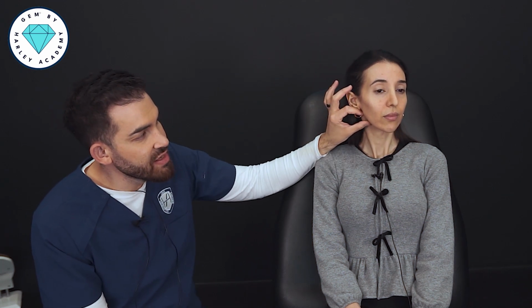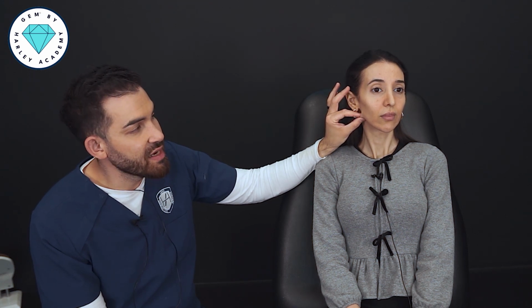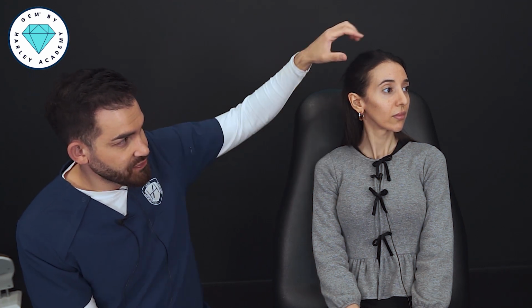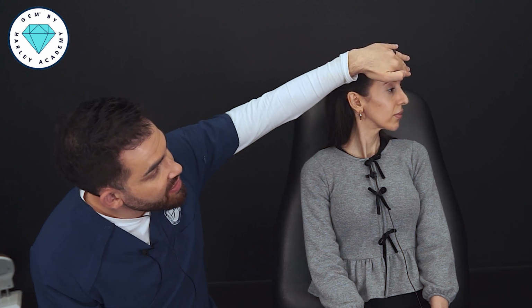Moving into the lower face, I think this is really where we see a real opportunity. I think that the bizygomatic distance is very wide. The bigonial distance is relatively narrow. And in this case, we can afford to really create some structure here in the lower face. I want to widen this here because I think it will balance the face. And then in addition to that, I'm going to try and continue the jawline all the way through to the chin. On profile, I think she's a very good profile balance between the upper face, the nose, and the lower face and the lips. I don't need to add any additional support or structure to those zones.